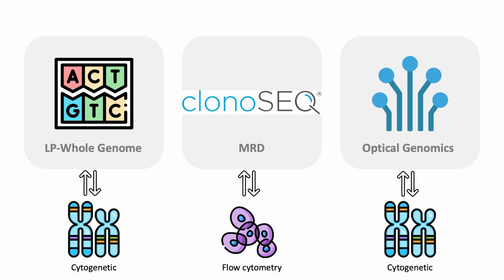So in my talk, I will speak about 3 things. One is something called low-pass whole genome sequencing. It's NGS-based, but it's a different flavor, very cost-effective, and it's really close to the cytogenetics. So there will be a huge interaction between these two sections. The second is the clonoSEQ method for minimal residual disease testing. This is recently FDA approved, and it's very important and could work in concordance with the flow cytometry.